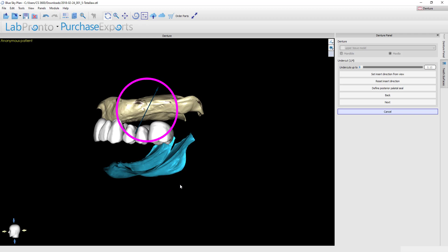For example, if you had to print this as a try-in denture and you're going to then conventionally process it, well then that denture base has to go on and off of that physical stone model. Obviously if you have any undercuts, that's not going to be able to happen. So you would definitely need to block out all the undercuts and you would want to take this all the way down to zero.